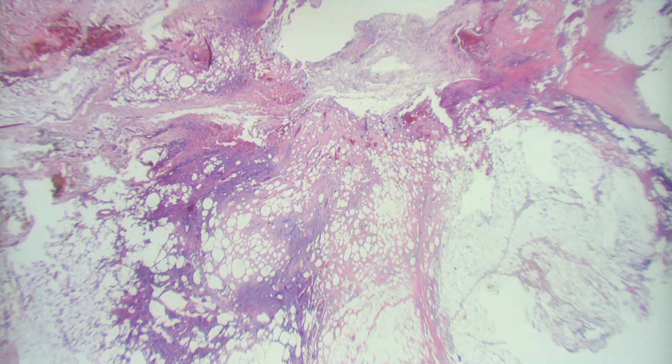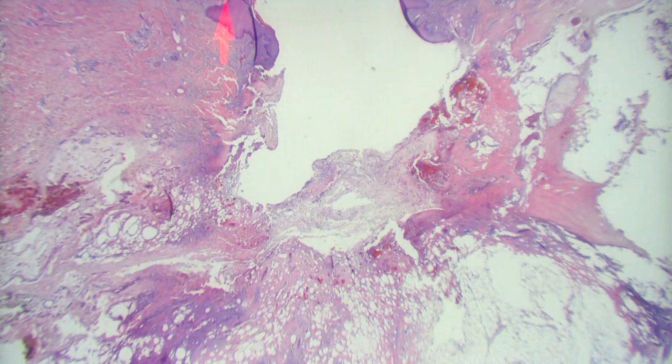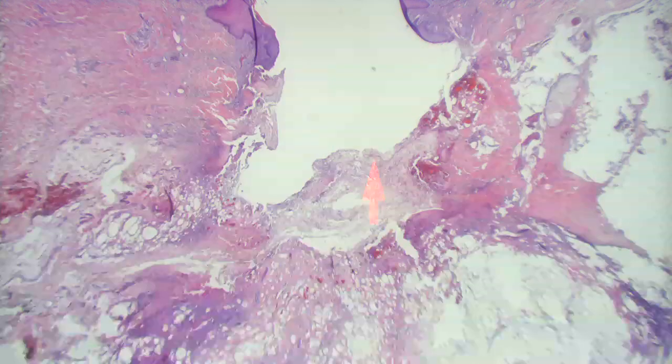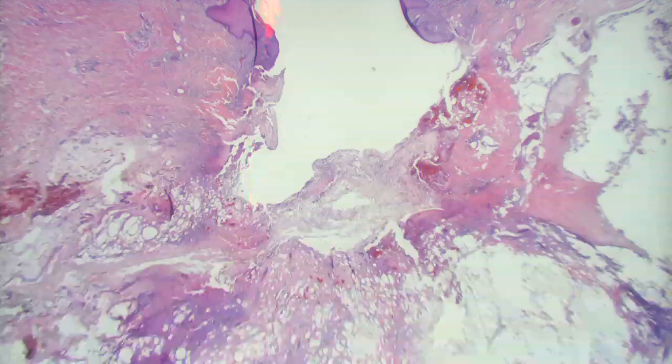What's going on up here? There's like necrosis or loss of epidermis for some reason. Yeah, so there's an ulcer, and it looks like it's pretty much sort of punched out. So when you see that, you say, wow, that might be outside in. Most sort of localized ulcers like this don't happen from an endogenous source. If there were a lot of vascular compromise, it probably would necrose everything. It doesn't just give you a little localized, well demarcated, punched out ulcer.